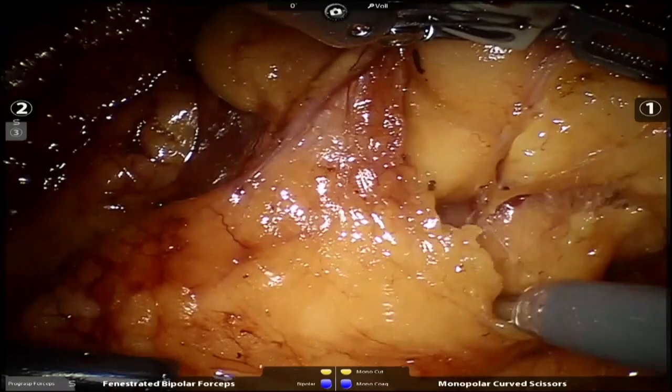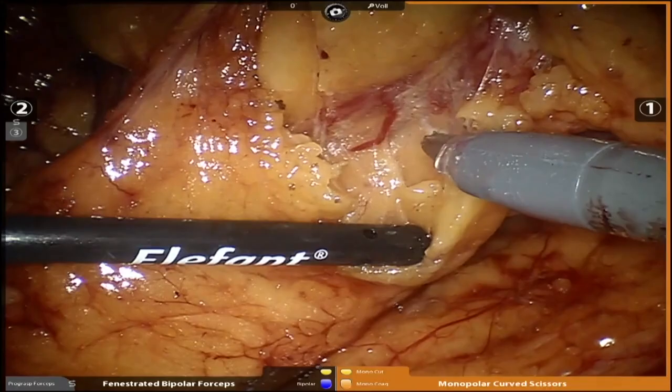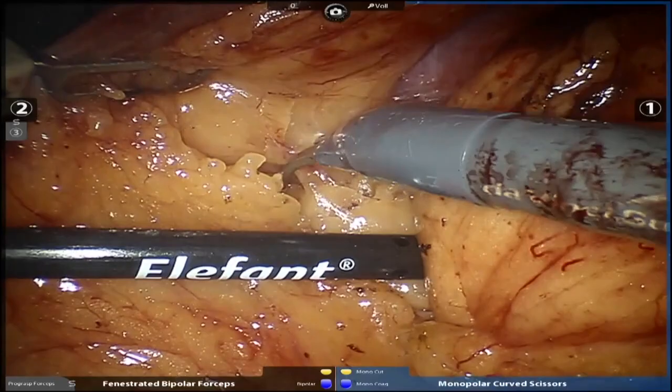Obviously, it was nice to find the ureter early on. When you're dealing with a lower pole tumor, it's really good to know where the ureter is early on, because you don't want to get into it. There's tumor there, so what I'm doing is working around the bottom. I have pretty good access today, and I wouldn't normally. Sometimes this can be quite challenging, right here, Brandon, because the lower pole tumors are very difficult, but I kind of accounted for that early on. This is one of those vessels that we saw.